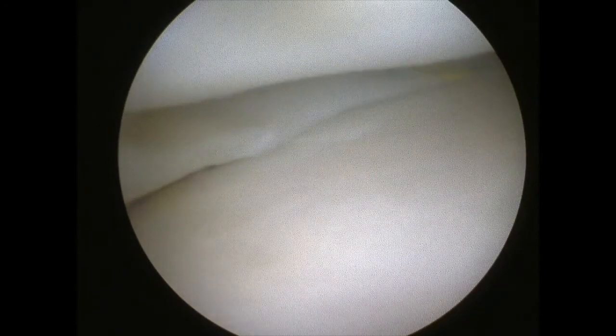Amazingly, it's reformed its central edge, and it looks great. I must have dragged down a little bit of fat with my knot, and that's why that suture hasn't fully synovialized, but there's no surrounding chondral damage.